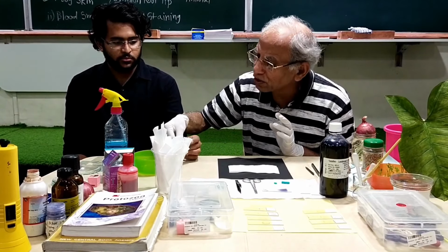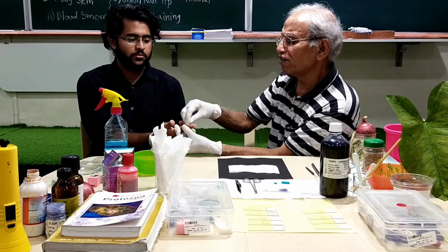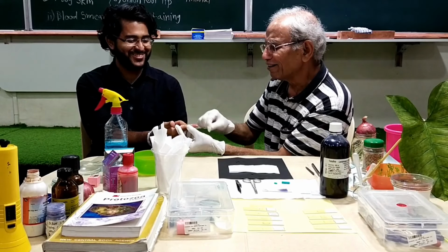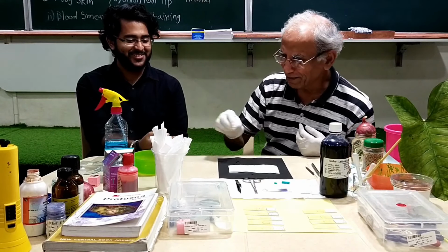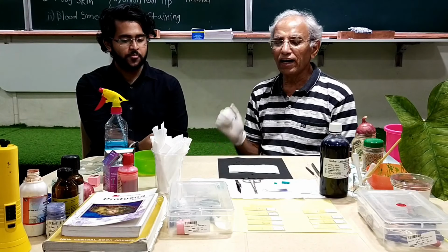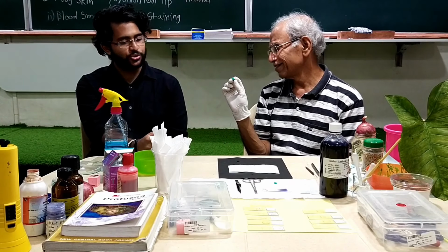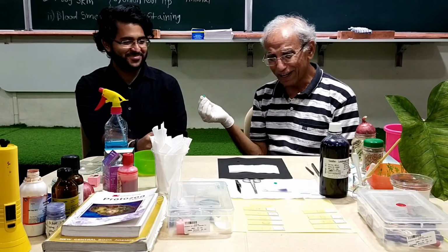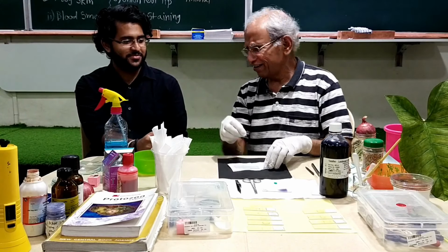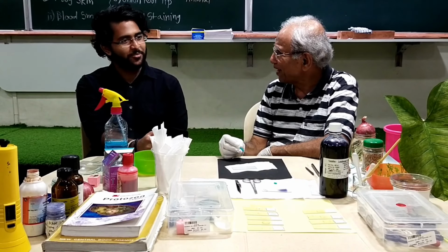I can now use this very tiny cotton swab. I'm just going to clean it here. See, are you feeling good, right? Yes. Oh, that's it. Alcohol. That's nice. Okay, let it be dried, and I'll just put this tiny thing into your finger. Sure. And you'll not even know about it. Okay, and I'm going to take that small drop of blood here on the slide. Okay? Are you comfortable? I'm definitely.